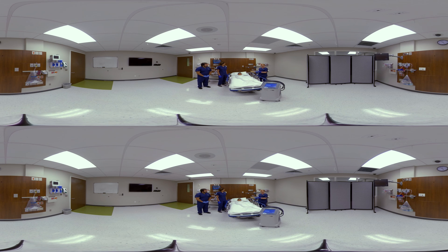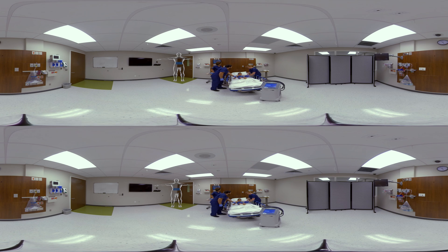For Cruz, because his skin is mature, we are going to peel off the cloth liner in order to expose the hydrogel and stick it directly on his skin for optimal heat transfer. For Cruz, we're going to use three gel pads: one on his torso, one on his back, and one on his thigh. I will place the pad on his torso so that the hoses are pointing towards my side of the bed, nearer to the Arctic Sun 5000, just right across his abdomen. Then we're going to log roll him to the side and roll him back.